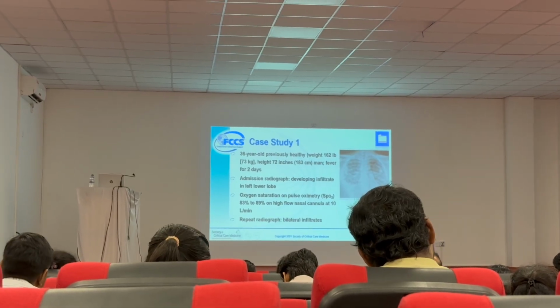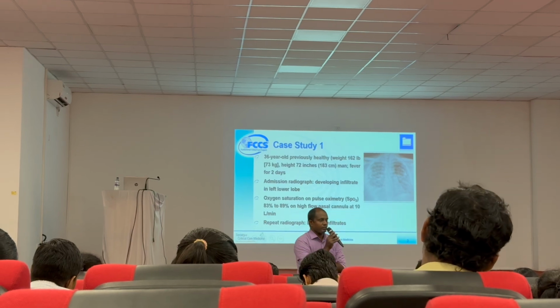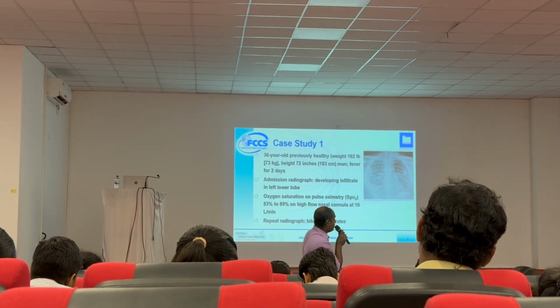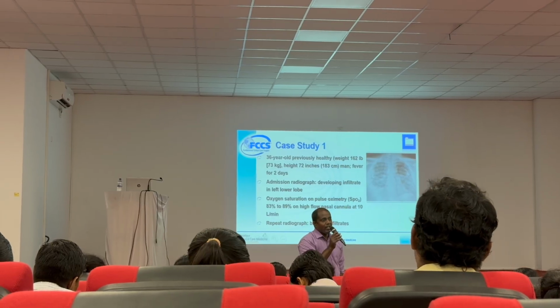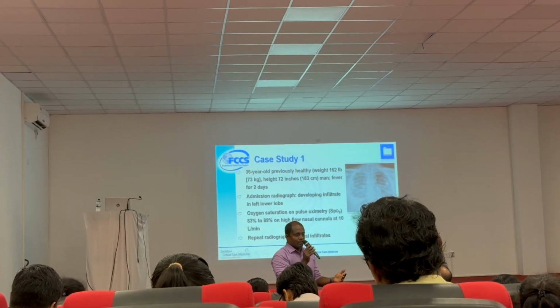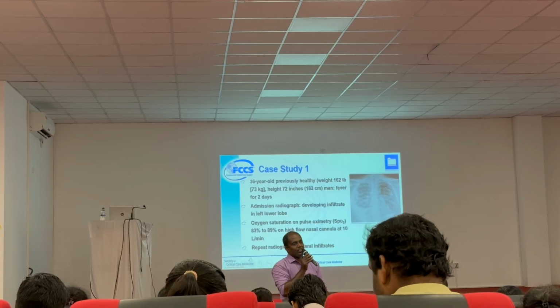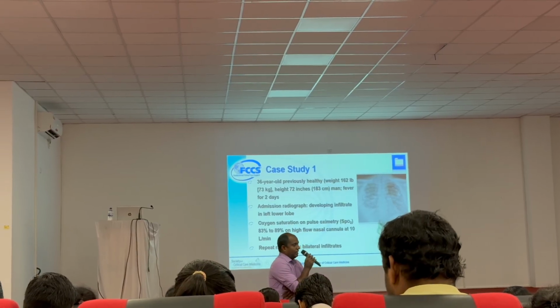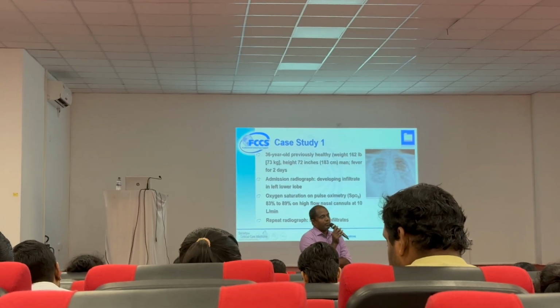The more time the patient is on inspiration, the more oxygen is delivered. That's the inspiratory time. You keep the patient artificially for more time on inspiration, and then more oxygen is diffused.